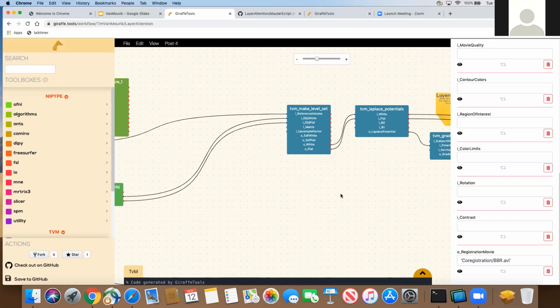Yeah, if I can just make one small caveat to both of those methods actually, is that both of these scans are really helpful if they look great. Unfortunately, unlike EPI, which is acquired very, very quickly, you don't actually know if a subject moved during those scans until afterwards. And I find this very frustrating. And unfortunately, I see no possible way to really find this out without some kind of optical motion tracker or something. The head case is a nice option.